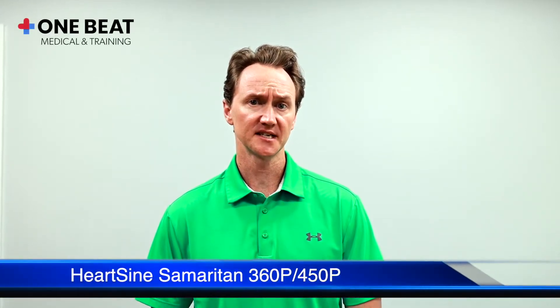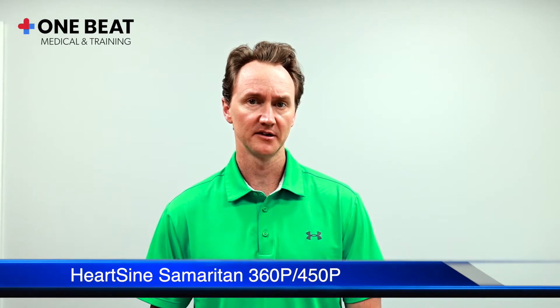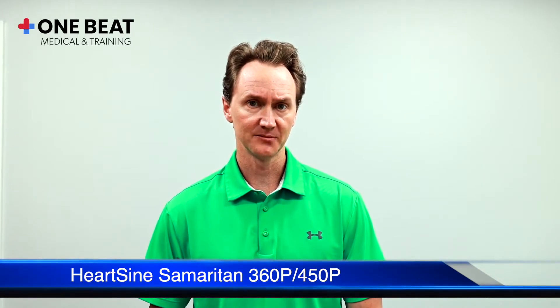Hello, today we're going to talk about the HeartSine Samaritan 360p and the HeartSine Samaritan 450p. The demonstration will be given on the 450p, but during the demonstration we will point out the similarities and differences between the two units.